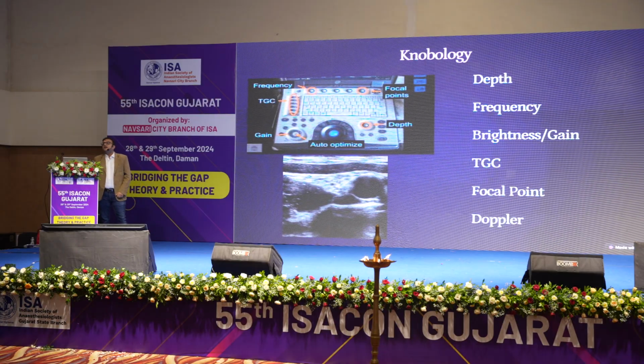And there is a time gain here. What is the time gain? Whatever picture you are seeing now is basically time travel. The first wave is generated, it hits the superficial object, comes back, and that first image is produced. Then the wave goes deeper and comes back, so the lower image and lower image. So the initial image is the first image, and after a fraction of a second, the other image is generated and the full image is generated.